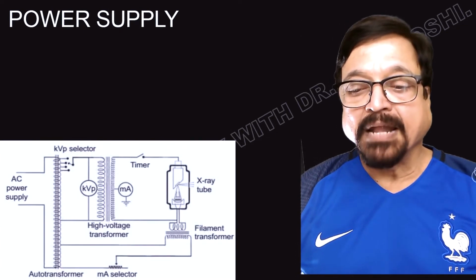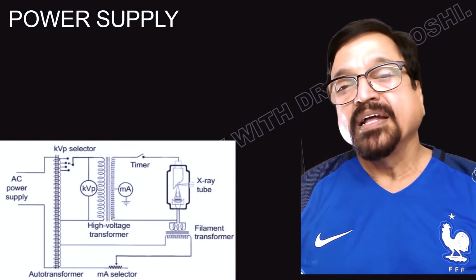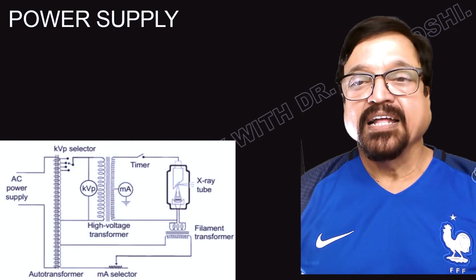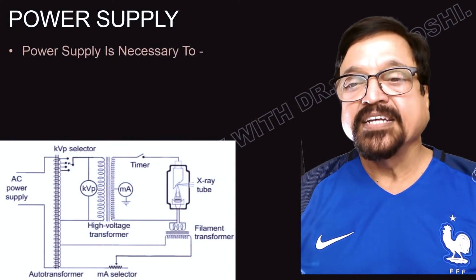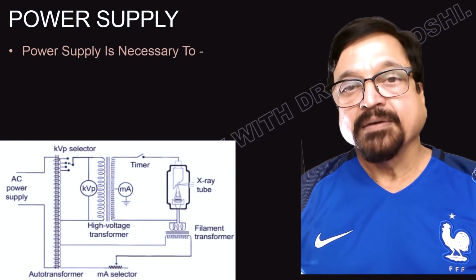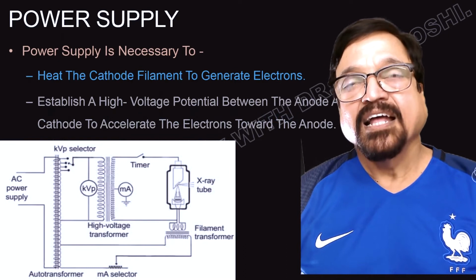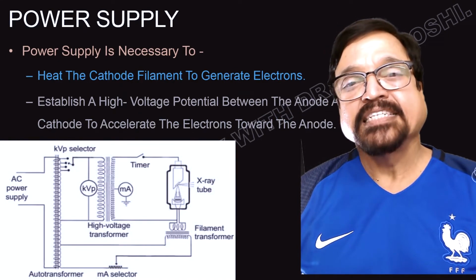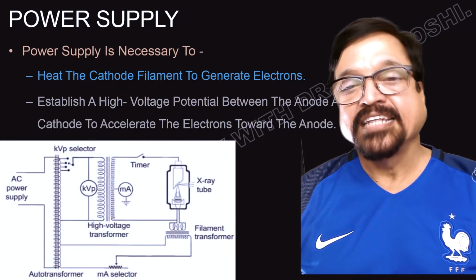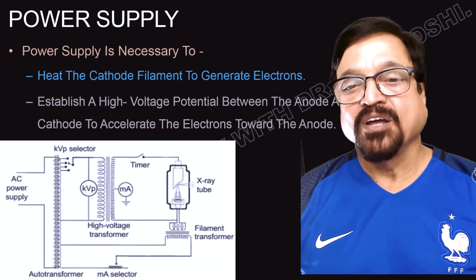Now you can see here primary, secondary, different types of generators used to give different types of power to the different units. These are all discussed in detail in some other lecture. We have another lecture in this same series, in short, in condensed form, and also in an extensive form in another lecture series. Both are available, condensed as well as larger or in detail.